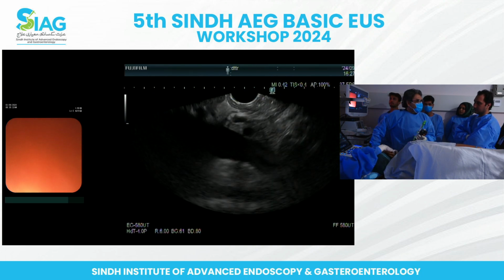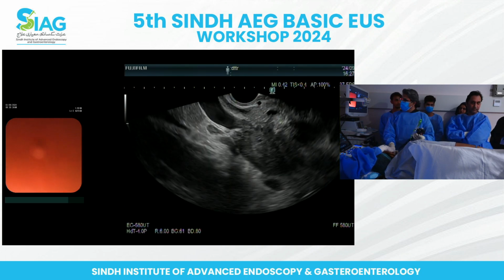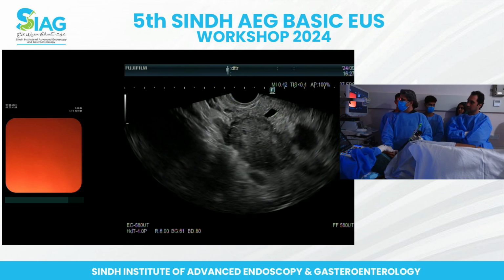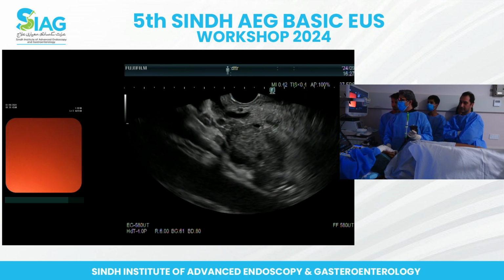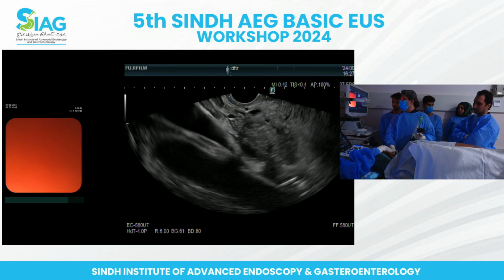it's a very unstable position of the mass. When the patient retches, it will move my scope quite significantly. Oh, you see? Yeah, I think it's mostly the heavy breathing. Whenever the patient retches, as you see, the whole dynamics changes there.